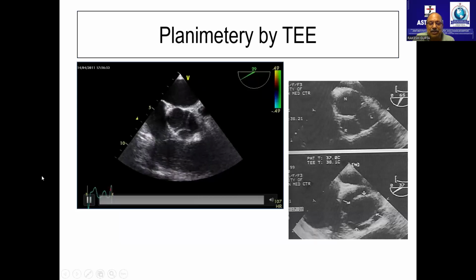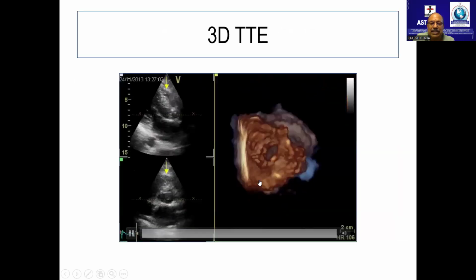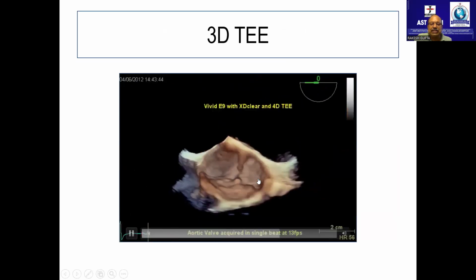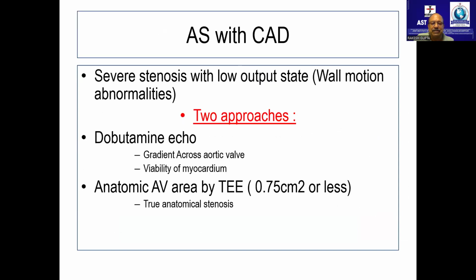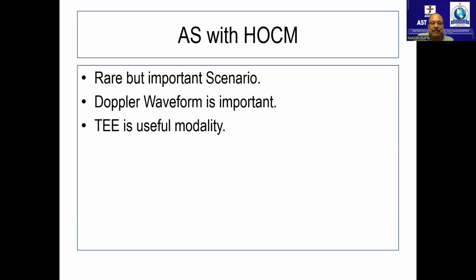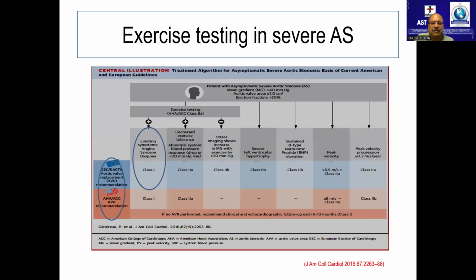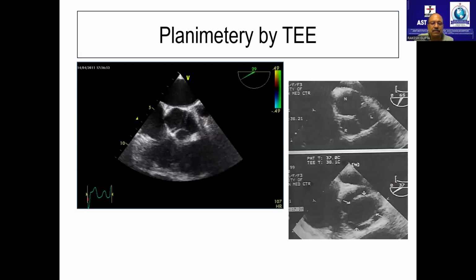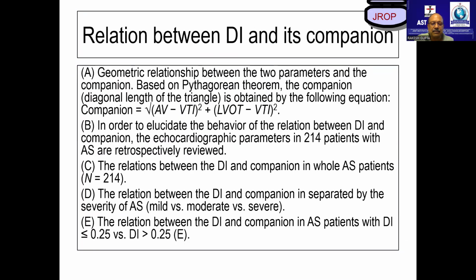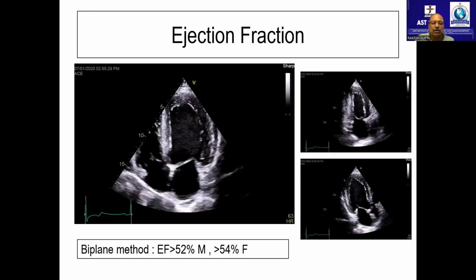Oh, you got the planimetry of the aortic valve area over here. Now you can see where I was looking at somewhere else. You can really planimetrize the aortic valve area. So we do a GLS in this subset of population. If the GLS is low, obviously we consider that the patient has got a subclinical LV dysfunction. GLS is global LV, global longitudinal strain.